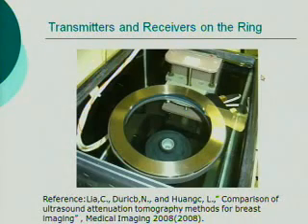This one is a real experimental setup. On the ring, there are 256 transmitter receiver sites, and each transmitter transmits a sound wave to all the receivers, and the receiver acquires time data for that path that the sound wave propagates through. And the object is in the middle of the ring.